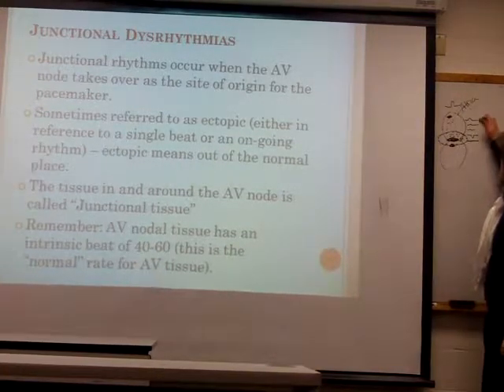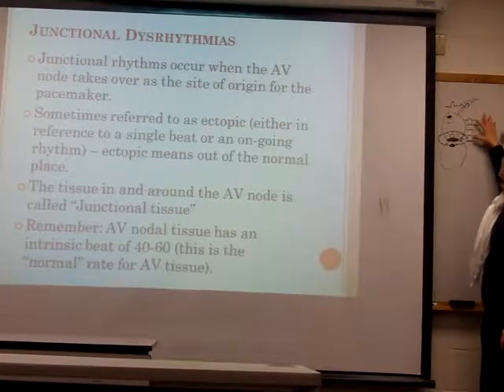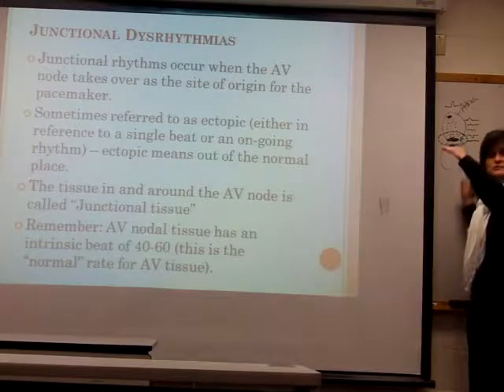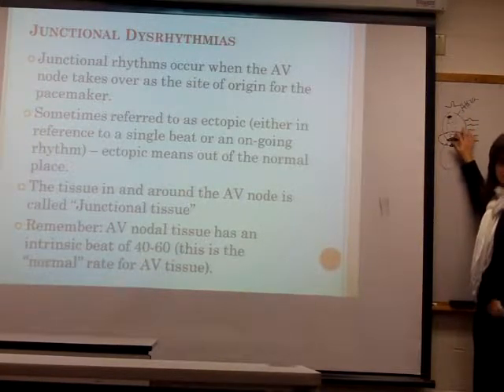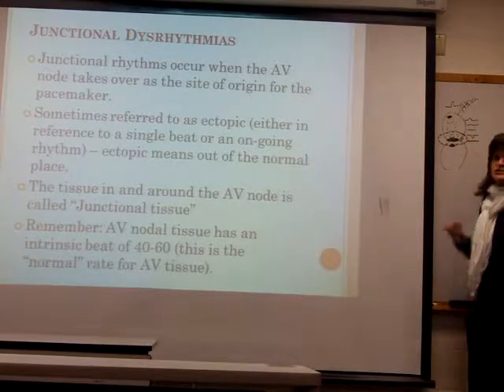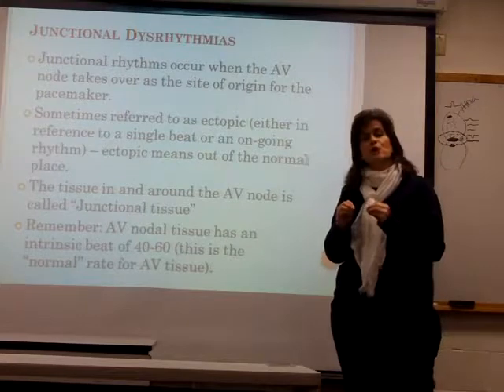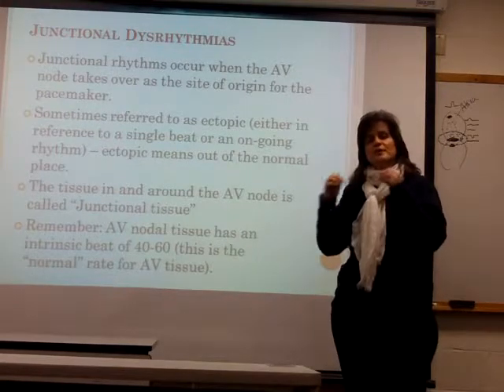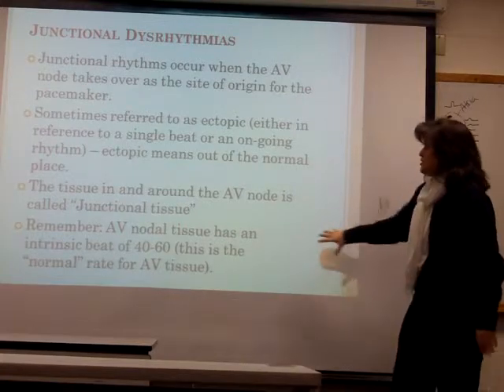Typically, you're going to either see a P wave that's upright, meaning the SA node is the pacemaker, or a P wave that's starting to be dampened or decrease in its size. That means that your pacemaker is moving down the internodal trackways, and then when it gets to the junctional tissue, it's either going to be absent or inverted. Either one, an absent P wave or an inverted P wave, means it's a junctional rhythm, okay? So that's what this is.